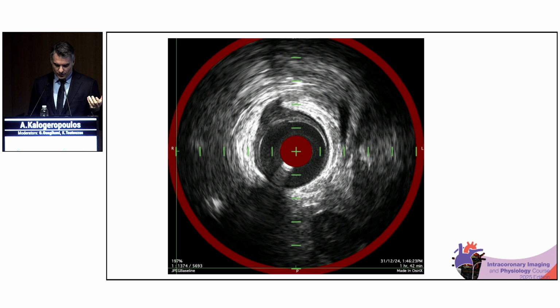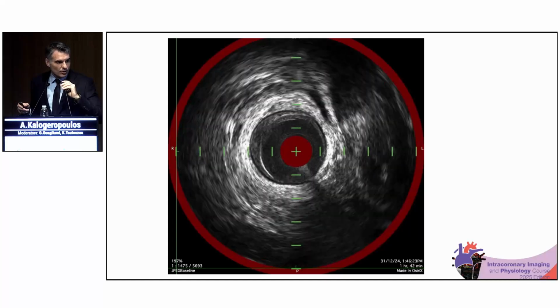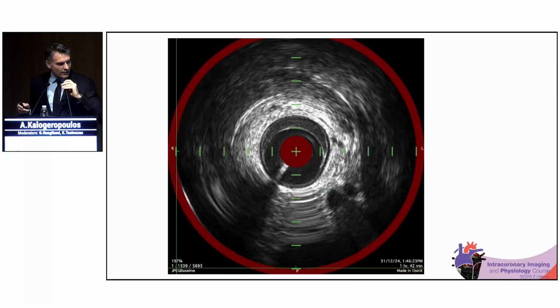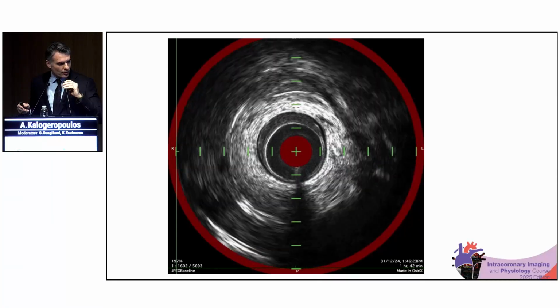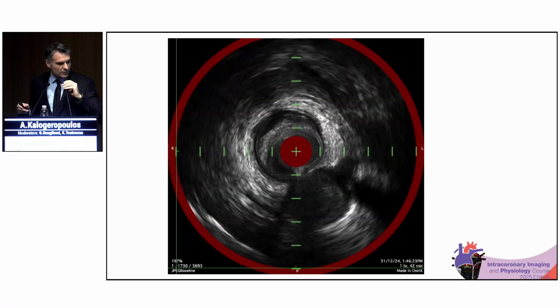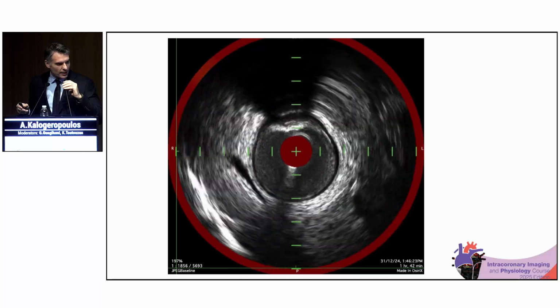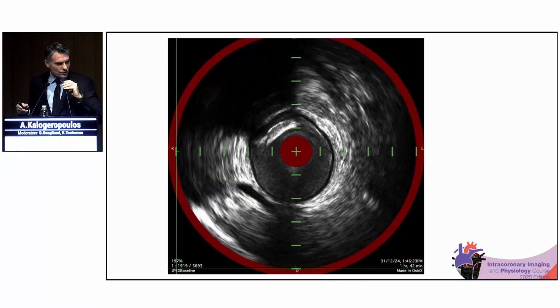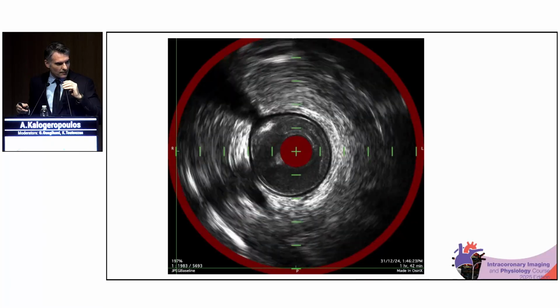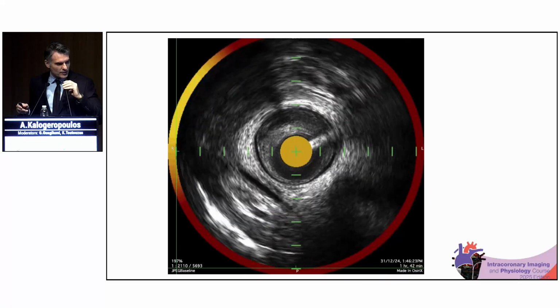The special feature with this catheter, so I'm going to run the pullback, is that we can detect lipid. And I find this a very useful information on how we're going to stratify the plaque risk, plaque vulnerability, how we're going to define our strategy on when we're going to treat this lesion, and then to optimize our PCI.